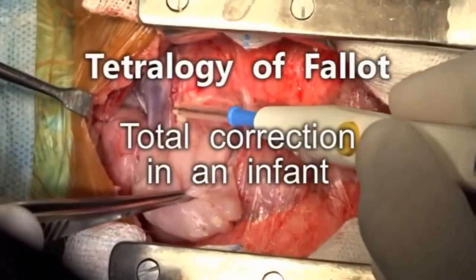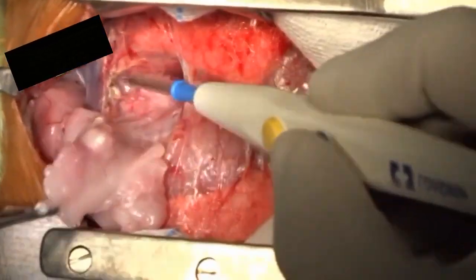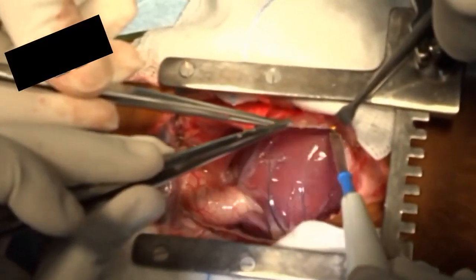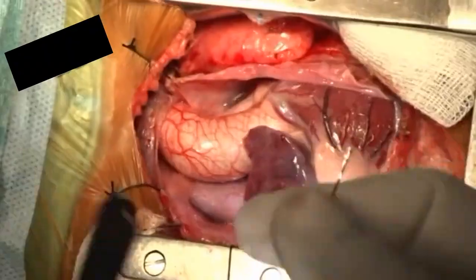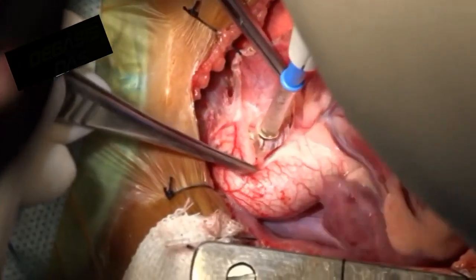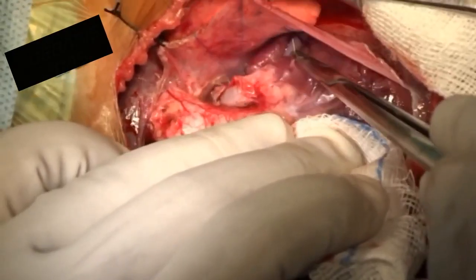This is a surgical video demonstrating total correction of tetralogy of Fallot in a 5-month-old, 5 kg infant. A median sternotomy has been performed, the thymus has been partially resected, and a pericardial patch is cleared for future usage. Pericardial stay sutures are placed, heparin is administered, and the main pulmonary artery is mobilized till the bifurcation.